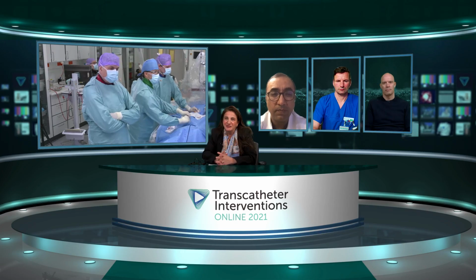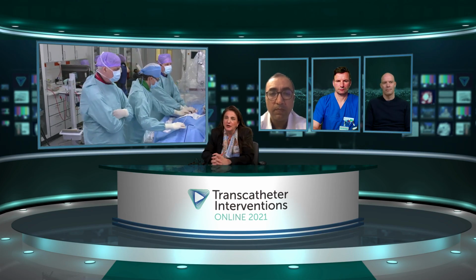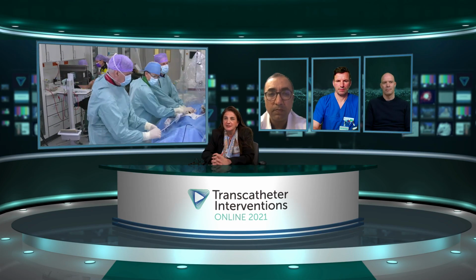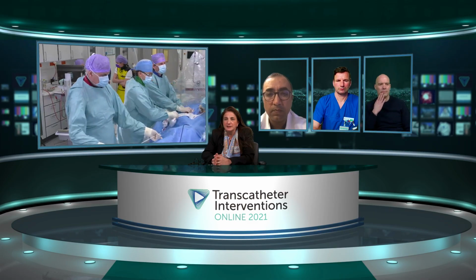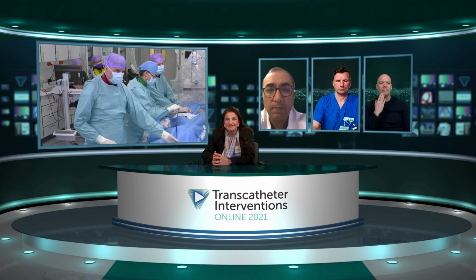I mean, this was a gorgeous demonstration, and now we're even moving to 4D CT ICE to evaluate these things. It's very, very interesting. Maybe I can have Holger, I know you have to leave us in a few minutes. How are you approaching these in Leipzig? And then we'll go back to Lars.